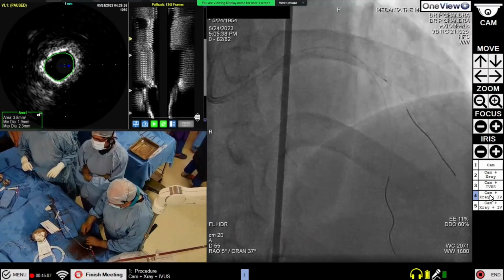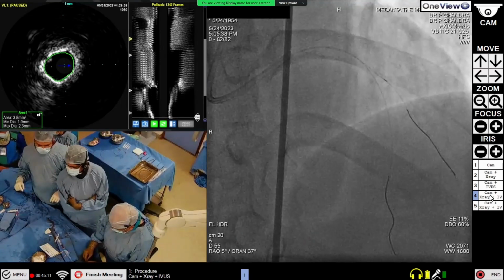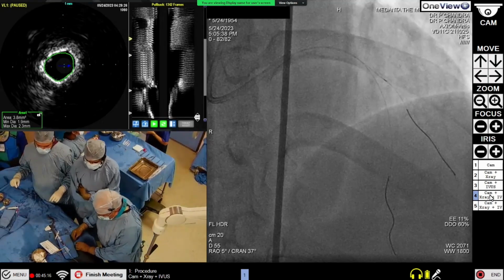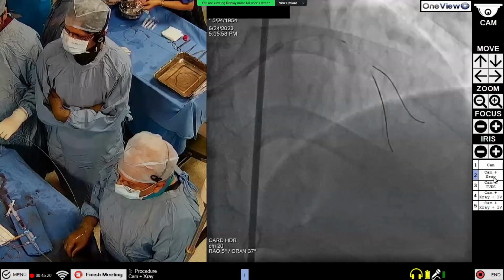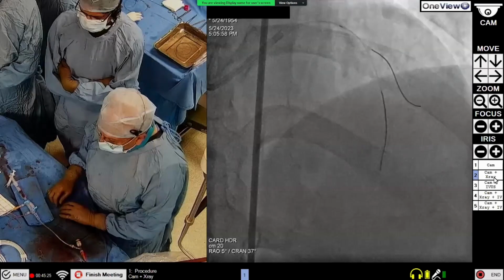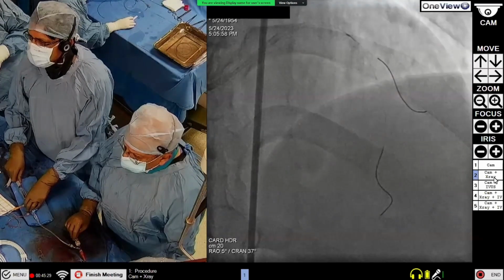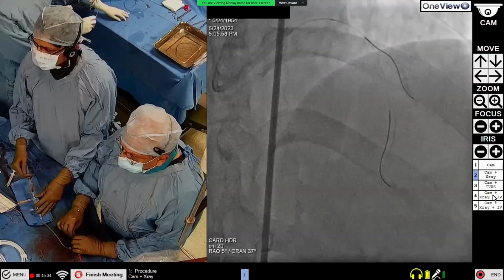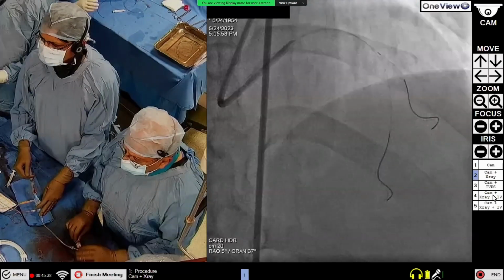So I think after the drug-eluting stent, this is the next revolution in interventional cardiology. When we are going away from the stents, definitely this is to be used by more operators. Right now, only few operators are confident in doing these kind of cases. So we have to see how well it is adopted by the other cardiologists. Once we have this de novo study, the results, in fact, in this Euro PCR, there was a presentation on the interim outcomes, which was looking quite good.